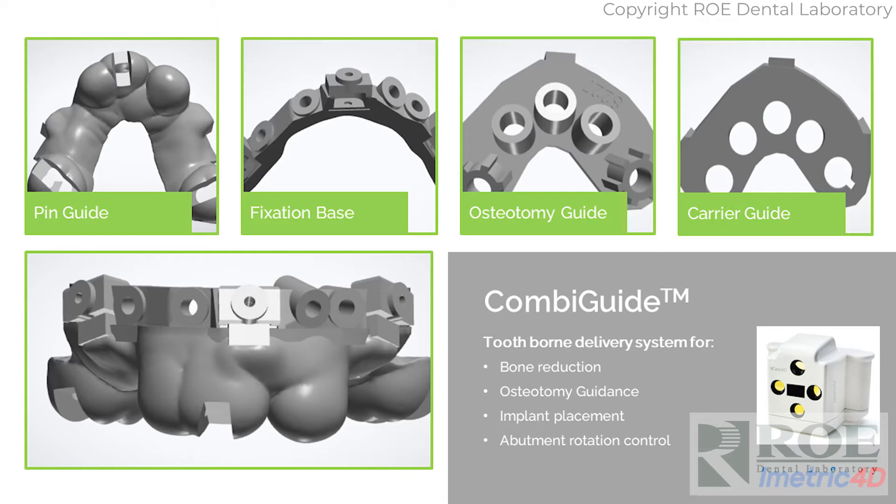We're going to go through a whole case from start to finish — a little bit of the ideas, the concept, and then what actually transpired during the surgery. What you see on screen is what we call a pin guide, step one. This is a tooth-borne or tissue-borne guide with windows for teeth. It delivers the fixation base, which is the bone reduction guide. The bone reduction guide and fixation base are what the osteotomy guide and carrier guide clip into. It's a stackable system that is fixated to the bone after the tissue is reflected. This is the assembly and all the components.